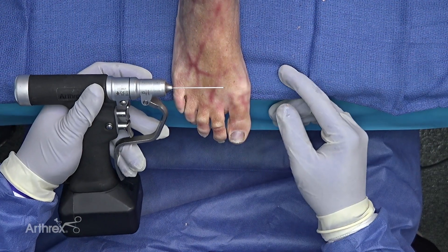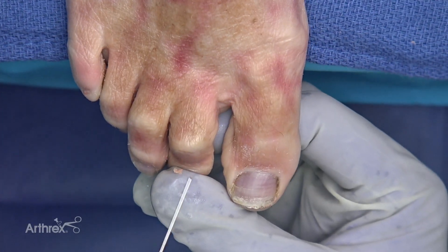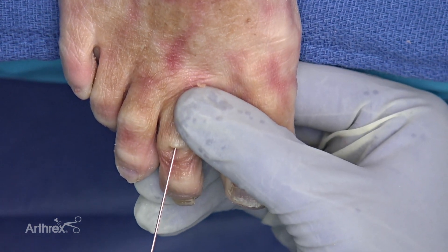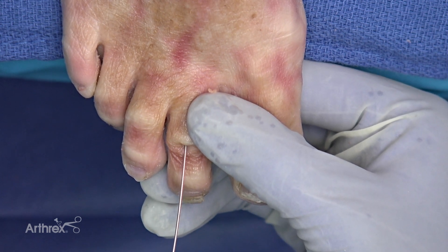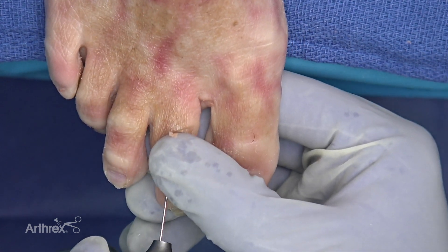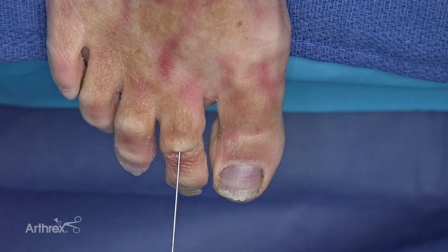Next we're going to use the 0.86 millimeter guide wire. This is the guide wire that accepts the drill for the 2.5 millimeter compression FT screw. I'm going to put this guide wire down into the intramedullary canal of the proximal phalanx. Because the overall alignment of the toe is contingent upon our drilling and the position of our screw, I'm going to check this under fluoroscopy.